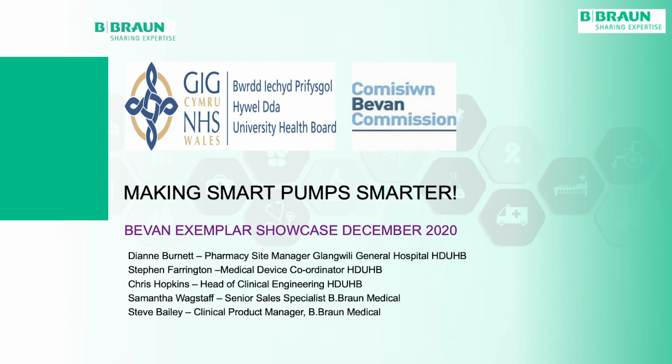So, just to give you some background very quickly, the Health Board purchased brand new smart pumps back in 2016, and we deployed them with infusion limits already pre-programmed onto these pumps, i.e. a drug library. Because of the massive logistical planning required to update these pumps with the configuration and the library, we haven't been able to do the updates on the library as we would have liked. And obviously drug information changes all the time, and if you want to maintain the governance of that library and the safety parameters, it's important that those reviews are done.